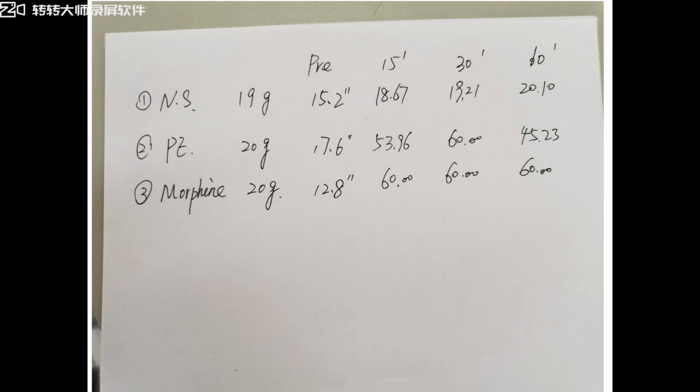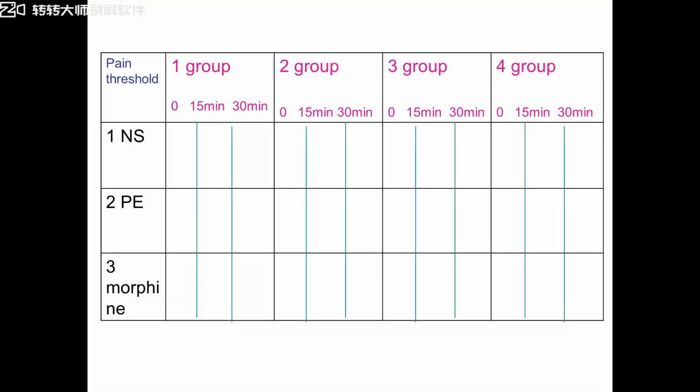Okay, let's continue. In this experiment, you should write down the results on this table. And if we only do one group, the result is limited, not enough.